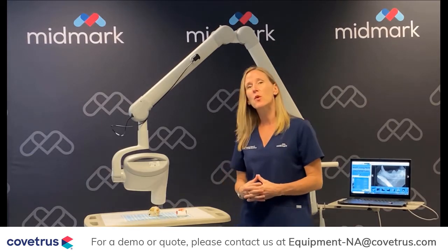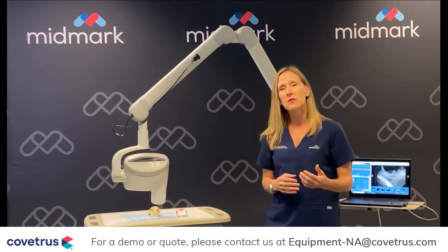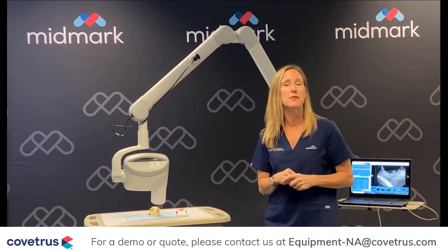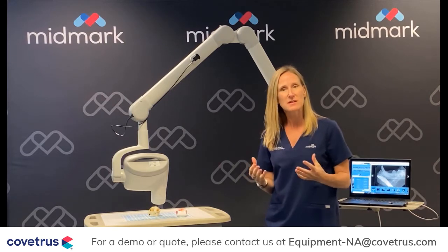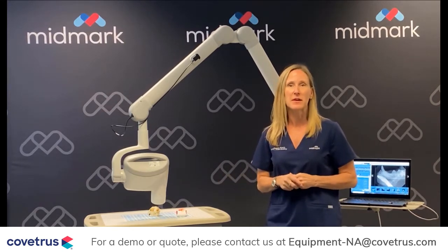Today I'd like to go over the Midmark DC generator. If you're new to dental x-ray or you're upgrading a previous generator in your practice, there are some things to consider when researching the different systems on the market.